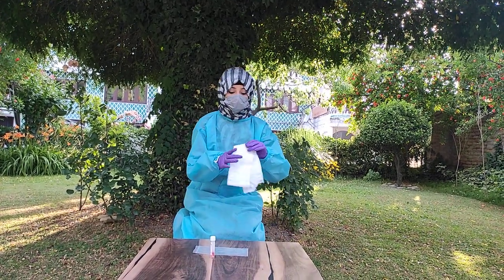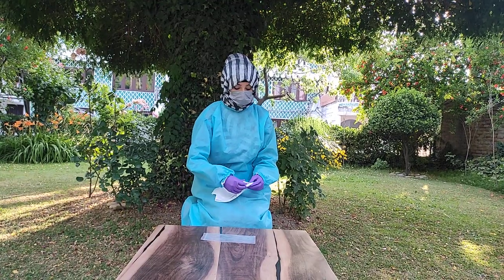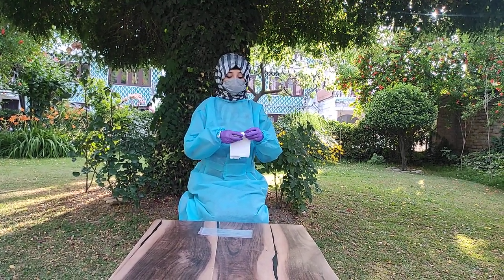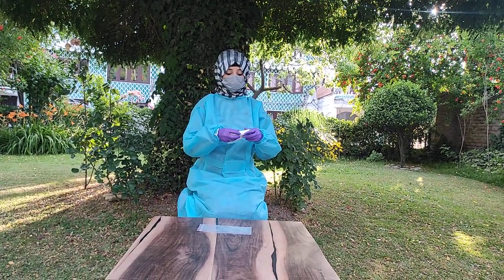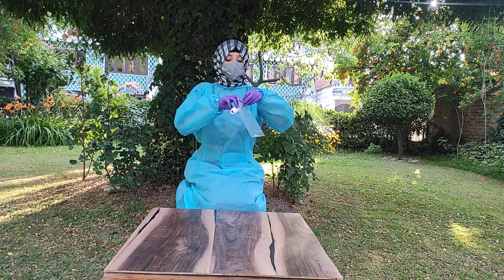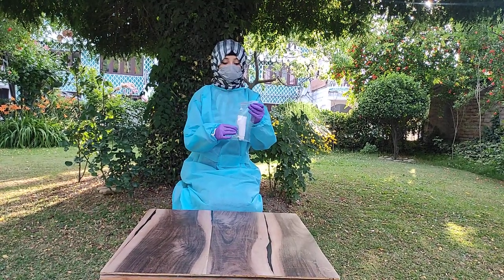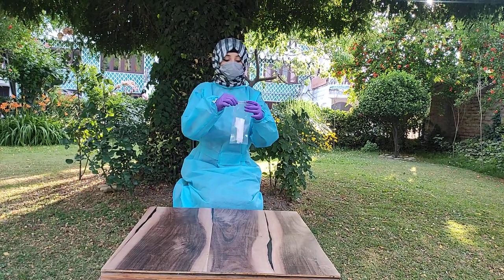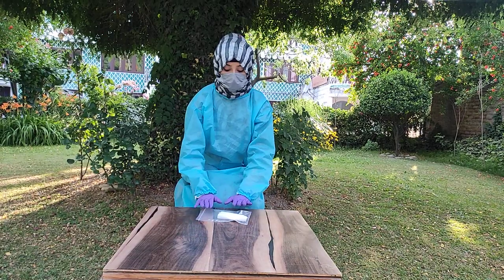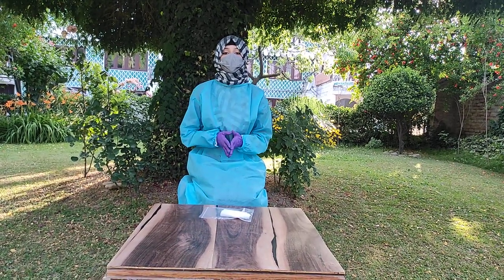Cover the VTM with tissue paper. Insert the VTM into a plastic bag. Then send the VTM to the laboratory for RT-PCR testing.